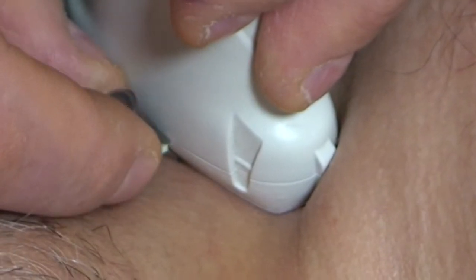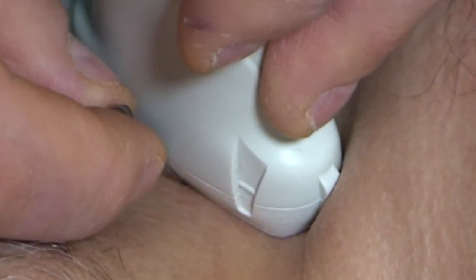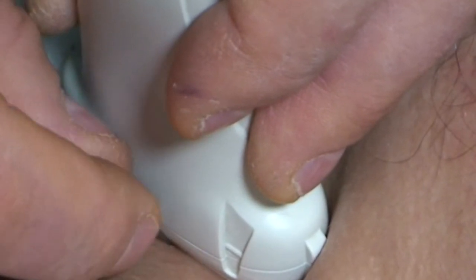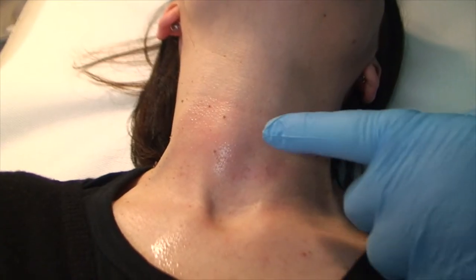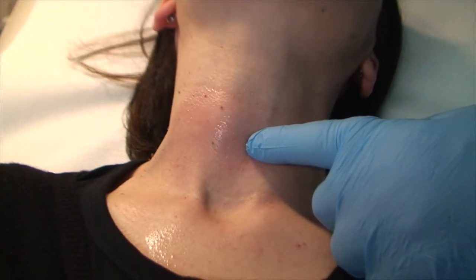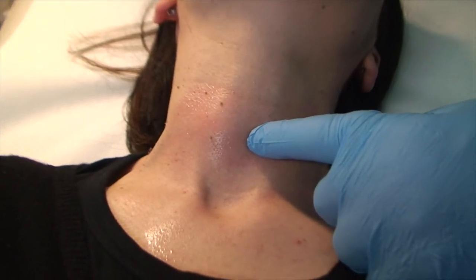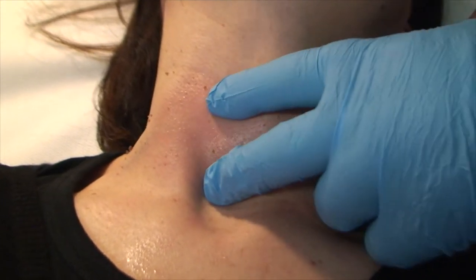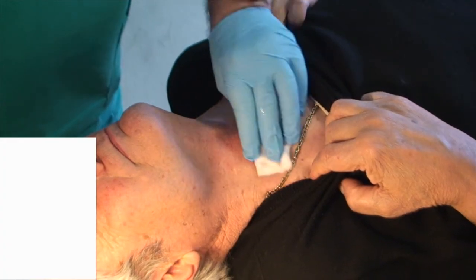For sampling, ultrasound scan guidance is recommended and even mandatory when the nodes are impalpable due to either their size or deep location. Whenever such equipment is not available on the spot, only palpable nodes can be targeted. With the patient lying supine, the operator approaches the patient from behind the head.